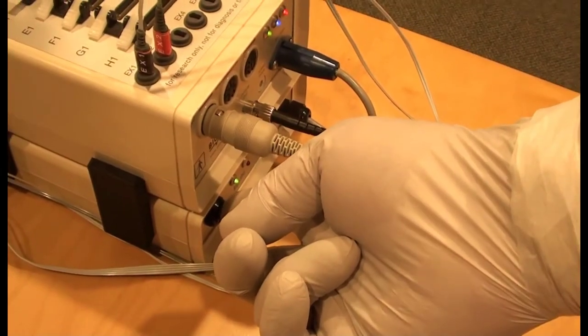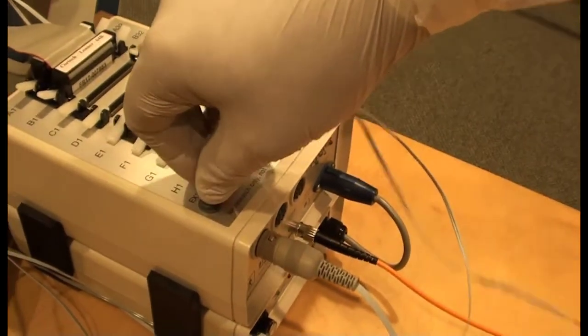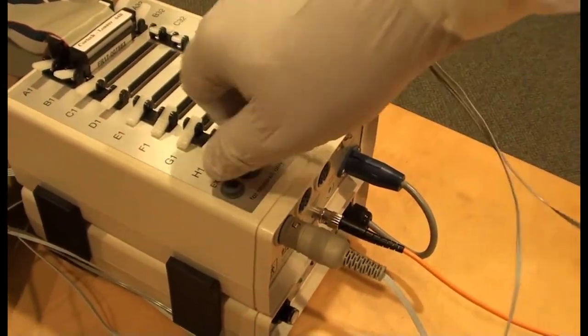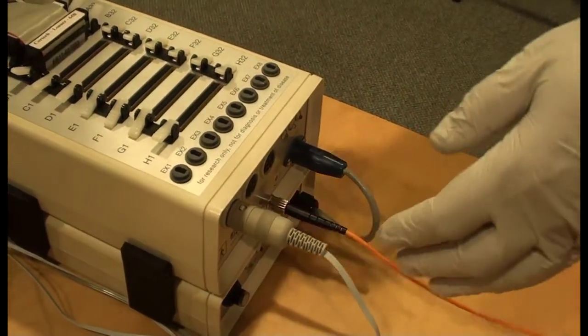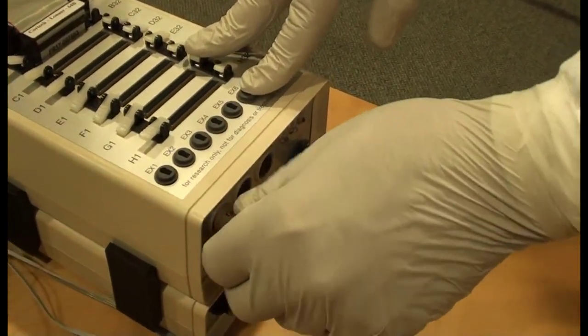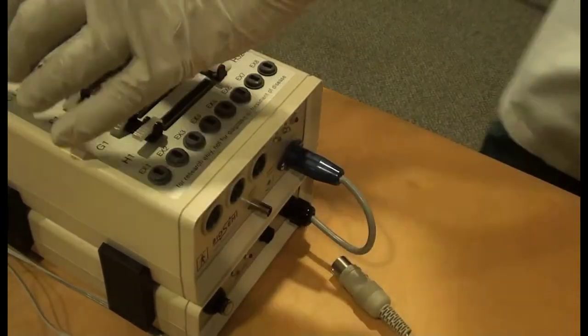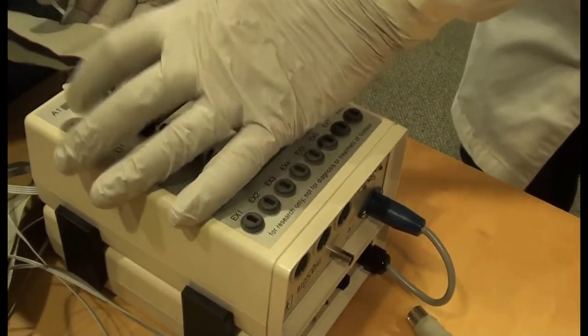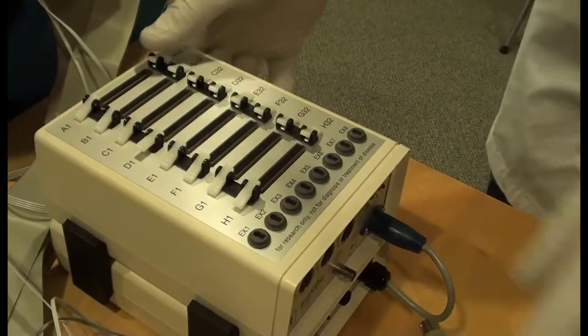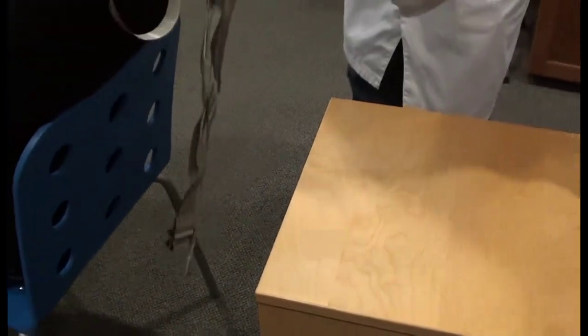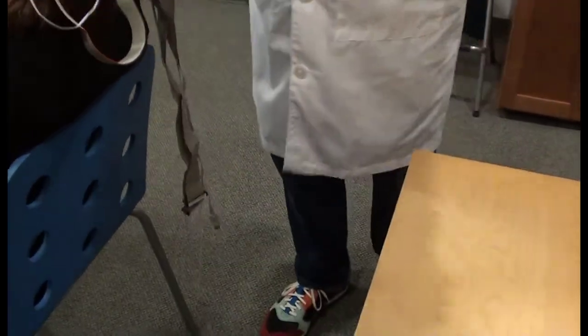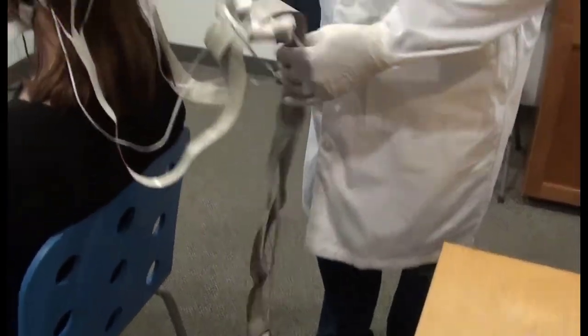Next, you want to turn off the AD box and unplug all the cables from it so that you can move it out of the way. The AD box is the most expensive part of the system, so the last thing you want to happen is for it to be knocked over or for gel to be dripped on top of it. Remove the electrode ribbon cables by pressing on the white connector ejectors and unplug the EXG and CMS DRL cables by pulling firmly by the connector housing and not the cable. Move the cart or cabinet holding the AD box out of the way and let the EEG cables hang straight down from the participant, being careful not to let anyone step on them, including yourself.